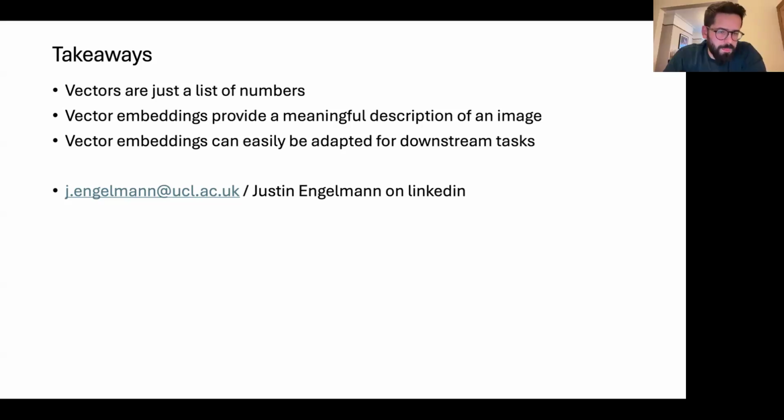Thank you. I had a really quick question, Justin. Let's say you use two foundation models with two ways to train them. One's a masked autoencoder, one's DINOv2. Could you find one or a set of vector embeddings that are extracting the same things? Like you said, one that has got the optic disc using one method, and the same thing has come out from another model, such that this is a base feature that seems to be important for both of those tasks.